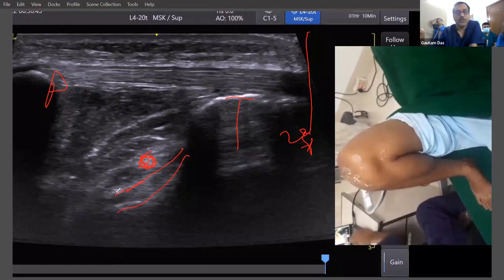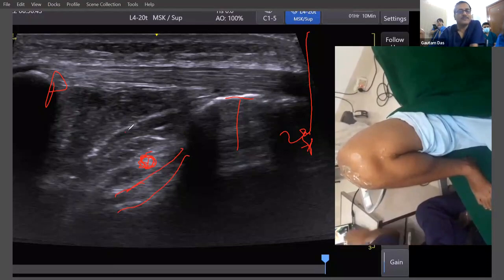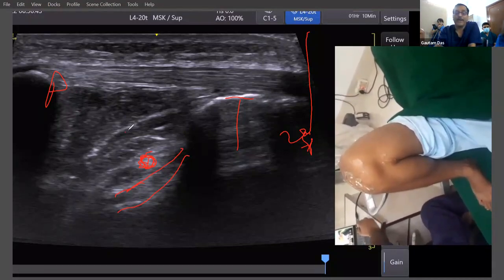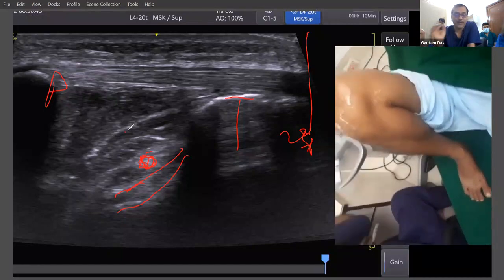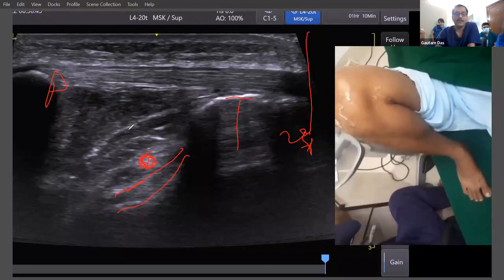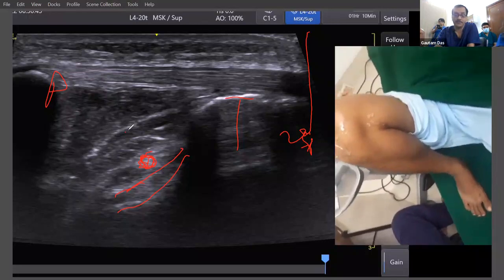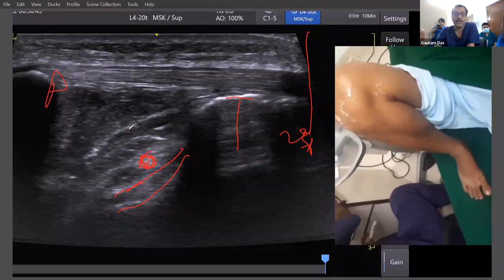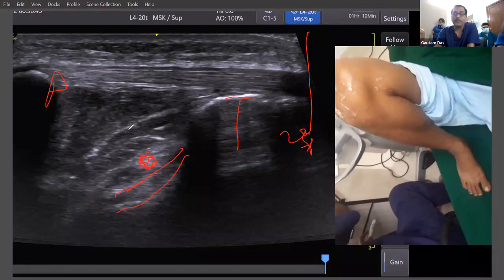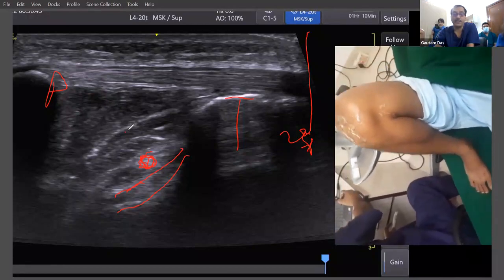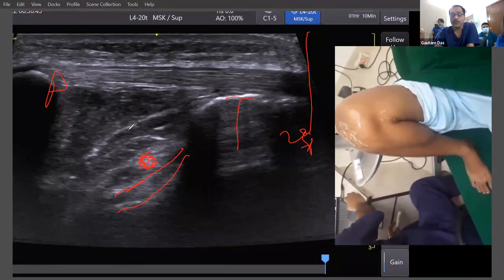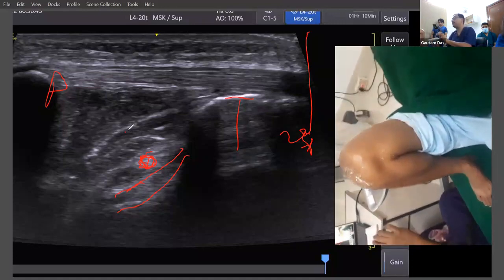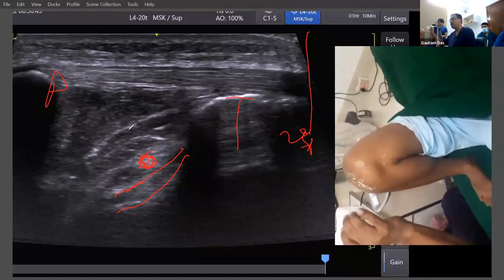This is the ACL. It looks very similar to the superficial layer of the Hoffa's fat pad, so there is a real chance of confusing which one is ACL and which one is not. So here are two tricks: first, find the intermeniscal transverse ligament, and second, find the correct depth — it should be approximately two centimeters from the skin. Then look for that area.